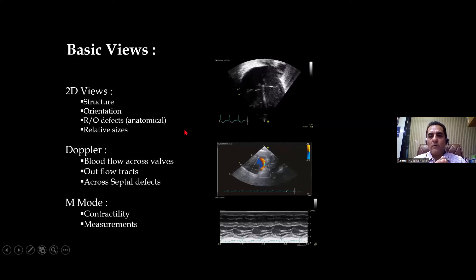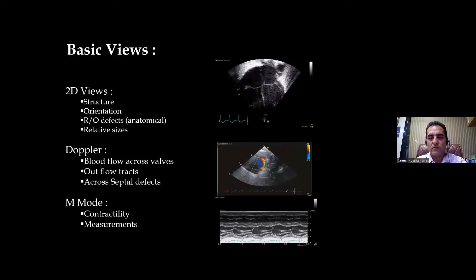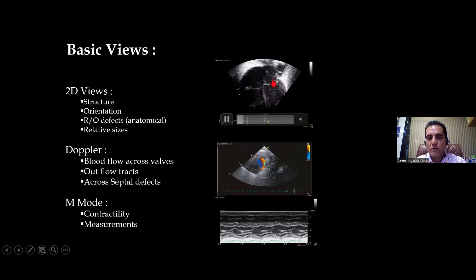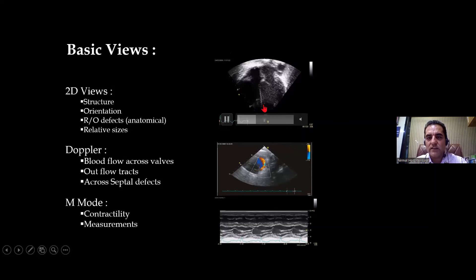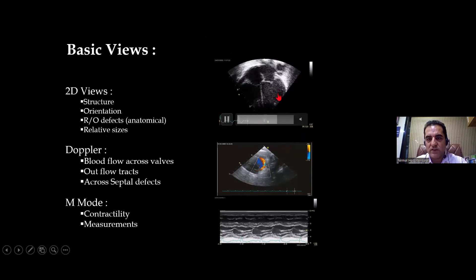Whenever we talk about the views, we always divide them into three segments. One is 2D views — as you can see, these are black and white, or grayscale views. What you see in black is mostly liquid blood, and the solid structures are gray or white. More solid and more dense appears more white; less solid and less dense appears less white. That depends upon the echogenicity of the structure — that is how our view will look like when we talk about 2D views.